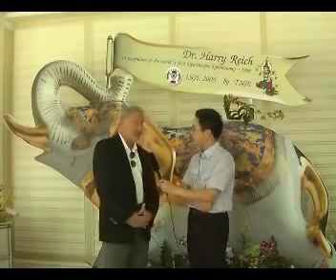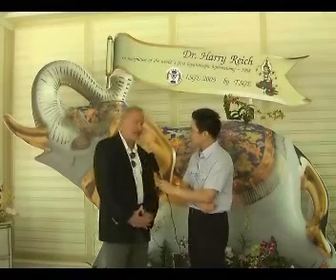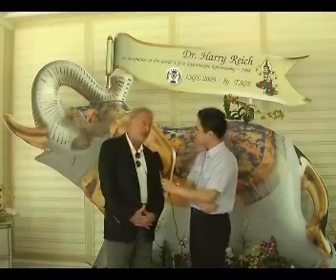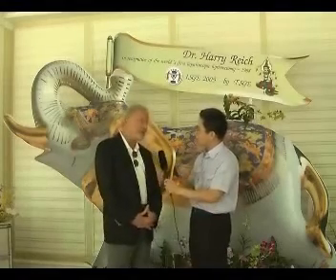But for me, back in the 70s, I got interested in laparoscopy, and I was also very interested in vaginal surgery. I did almost all my hysterectomies vaginally. I didn't like open operations with a big incision. So somewhere around 1980, I decided to look in with a laparoscope, and sometimes free the ovary or take down adhesions or excise endometriosis. And then I would do a vaginal hysterectomy.